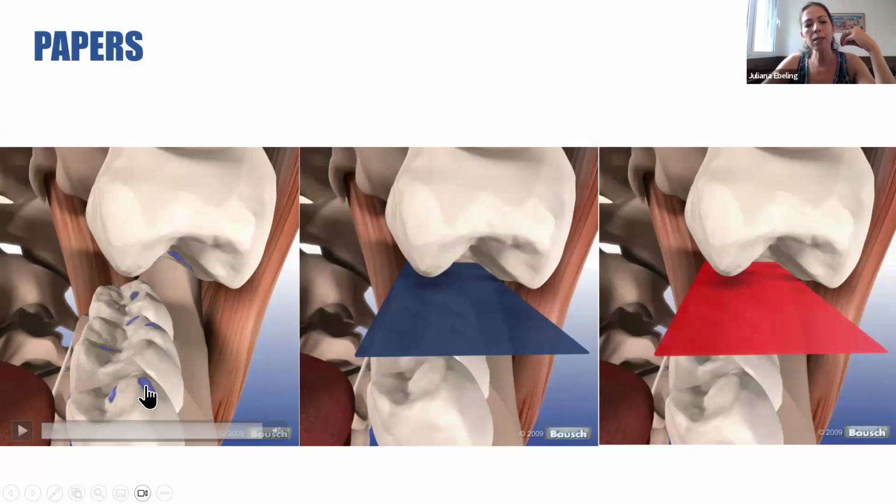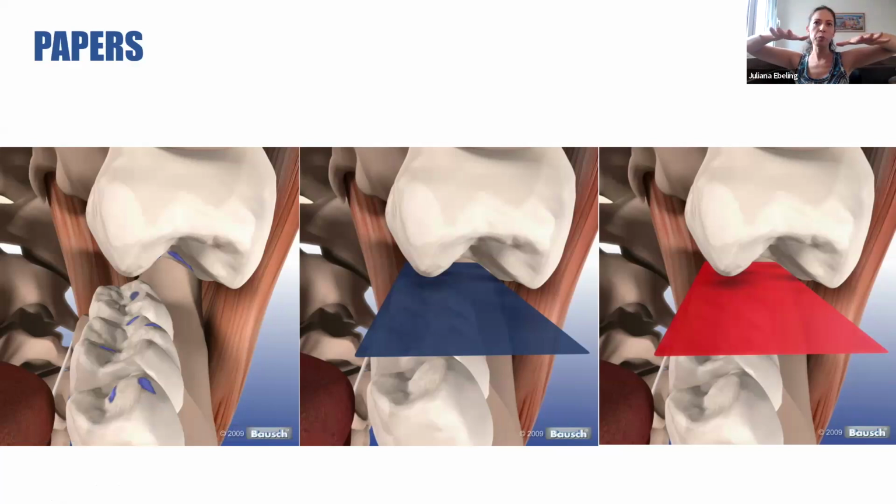What happens is the opposite. When we have a lot of pressure in this center, the color goes around, as if spreading this ink, because the pressure was greater there than around.